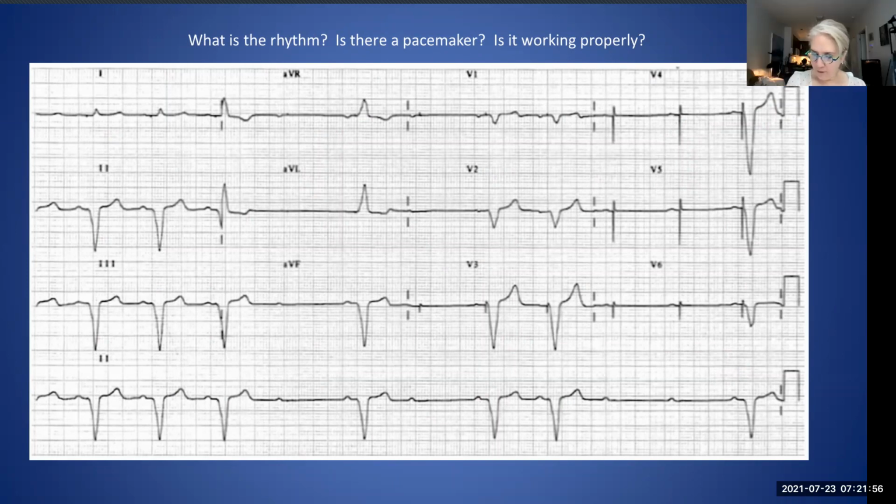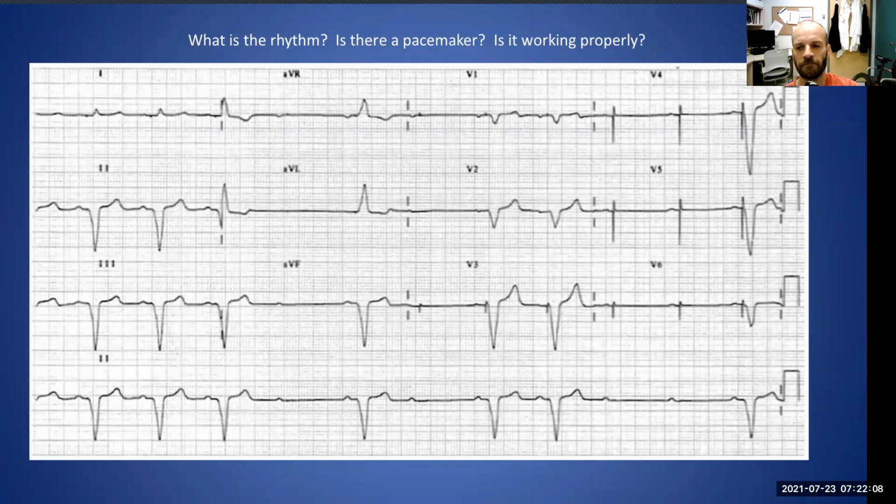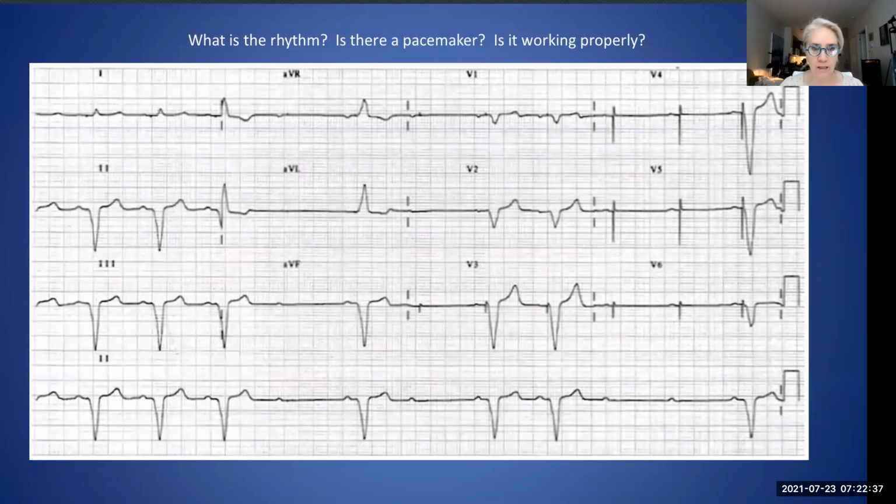Okay, I said that there was left bundle branch morphology. There's ST elevation in V2, 3, 4, and 5. Keep going. And then I said for the rhythm, second degree AV block type 2, the rate is about 48, and a left axis deviation. And then there's more. Ventricular pacing spikes are visible before some of the QRS complexes, but not all of them. And then some of the pacing spikes are not followed by QRS.